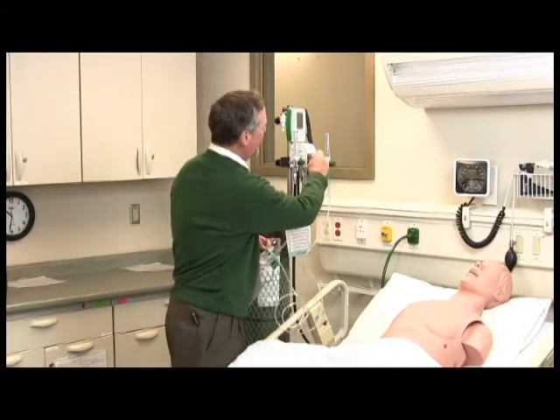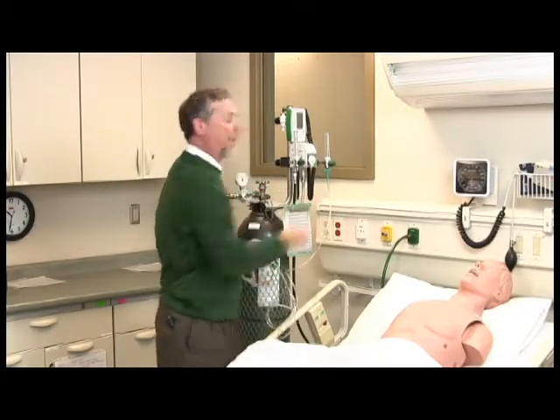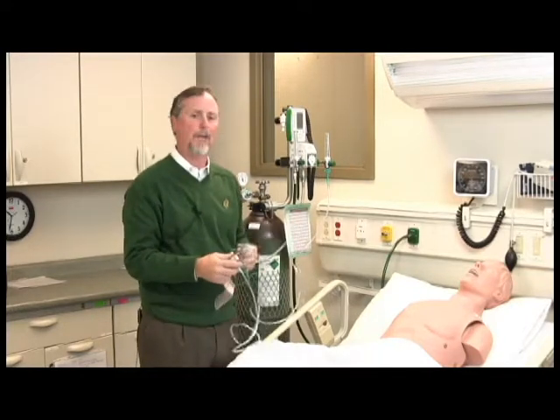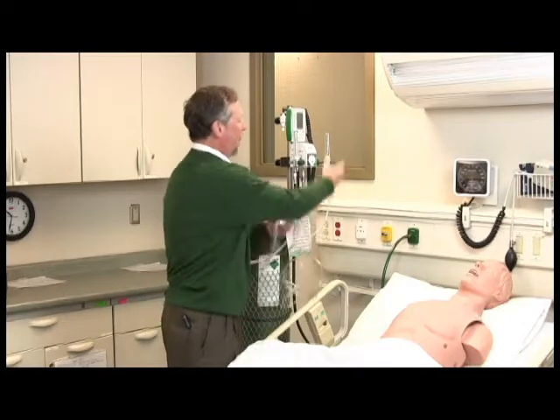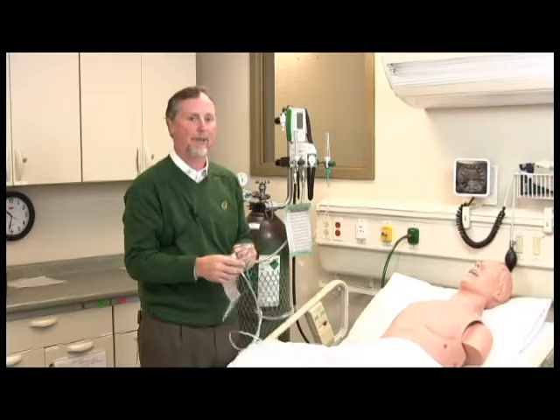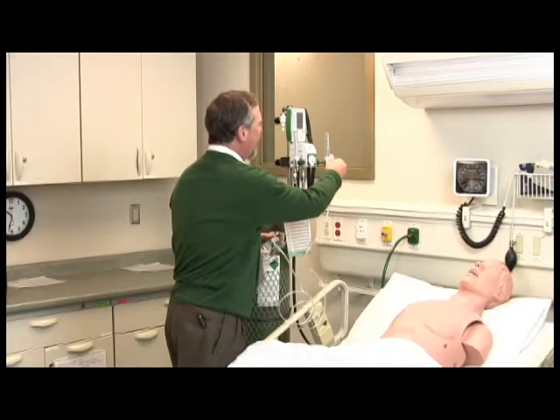Since this is an 80-20 blender, this blender goes from 20% oxygen all the way up to 100% oxygen. And we include 100% oxygen just in case, during therapy, if there's an emergency, the blender can be increased to 100% oxygen. If resuscitation is necessary, you don't have to undo everything and try to go back to the wall outlet. You can just hook up your resuscitation bag to the blender, dial it up to 100% and go from there. So we have this patient that's requiring 40% oxygen, and we'll turn on our flow meter and start flow.